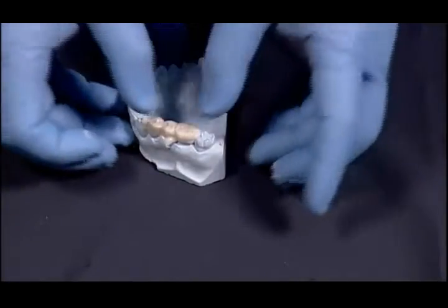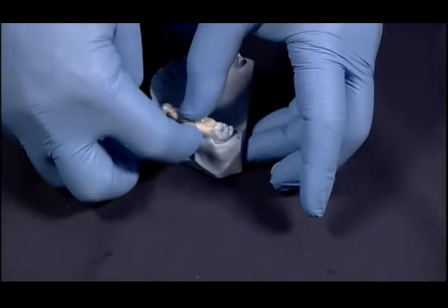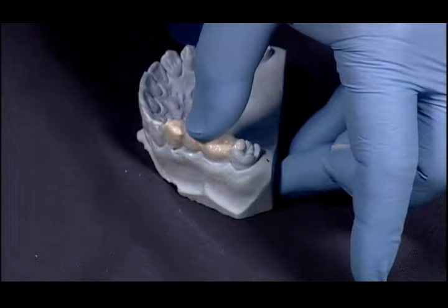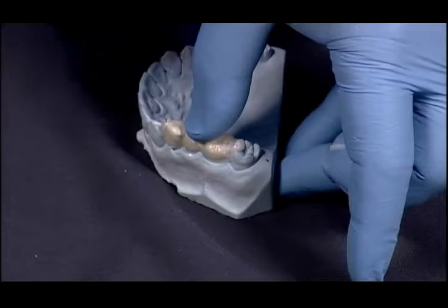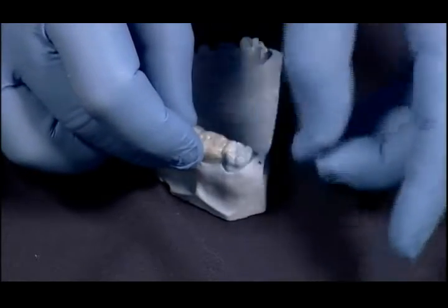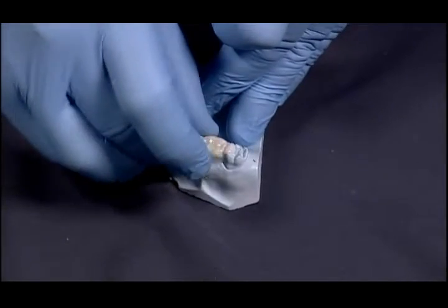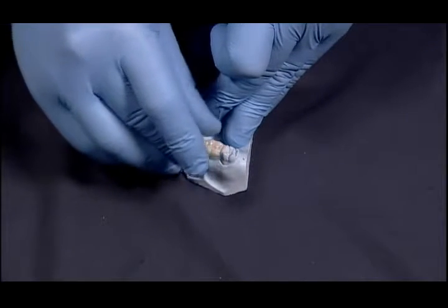So we're going to place the restoration onto the model, and at this point we can wipe off bits of excess that we would have within the patient's mouth. The Bis Acryl will set according to each manufacturer's instructions. What you don't want to do is let it get to a firm set before you test it to see if you can remove it from the mouth. So you will get it to the point where it starts to get into a rubbery stage, and then you'll tease it off and then back onto the model. And then tease it off and back onto the model.